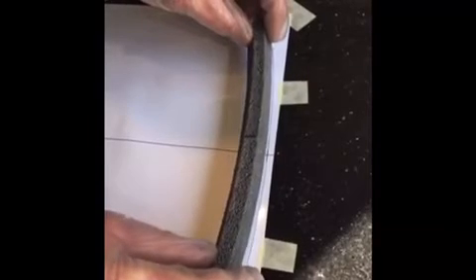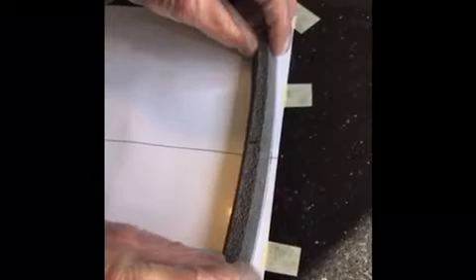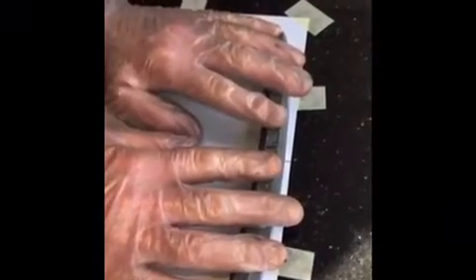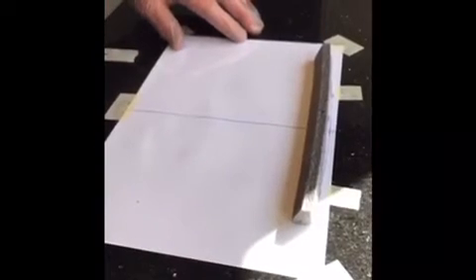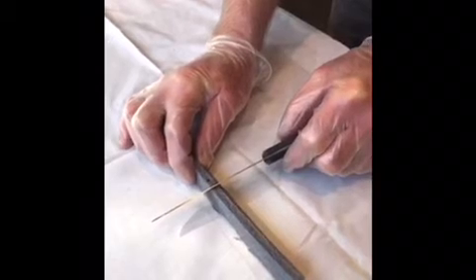Position lagging onto template, make sure centre line is in line with the centre line on the template. Remove and leave for 24 hours. Cut relief V's.